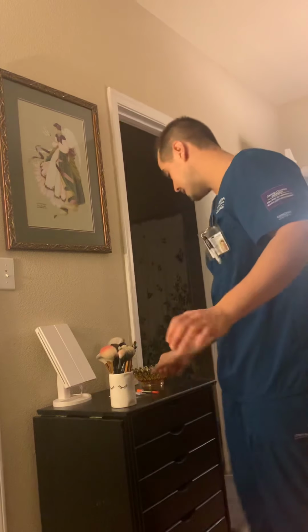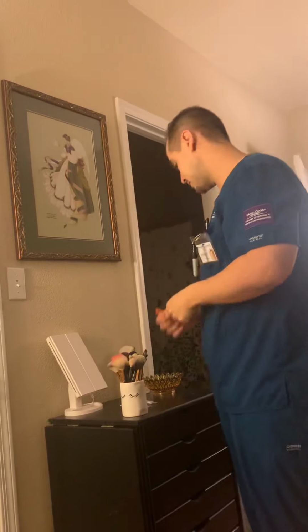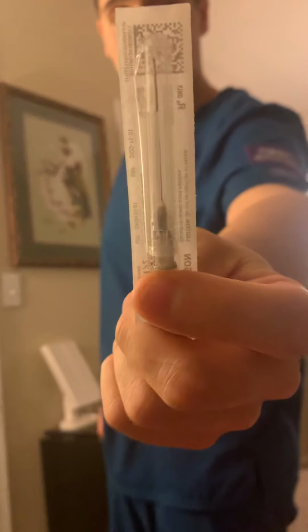And then an example really quick for the subcutaneous is going to be the classic insulin needle, which has about a 1/2 inch needle with a 29 gauge needle. So this is a good example of a subcutaneous. And then here we have an intramuscular needle. It's a 22 gauge by 1.5 inch. It is a big, thick, chunky needle.